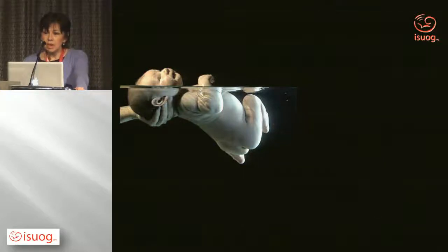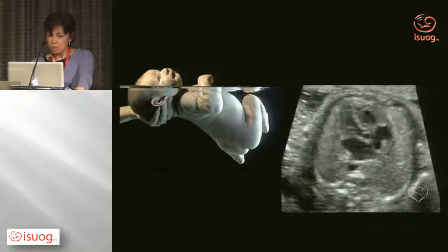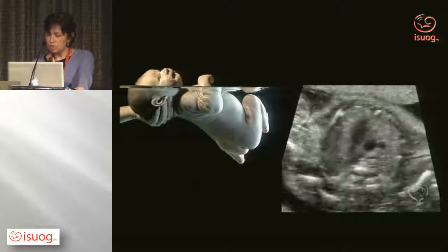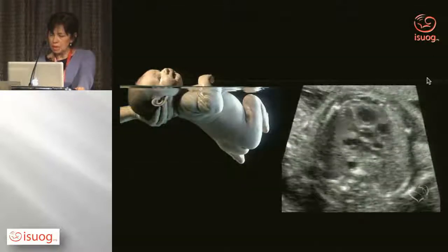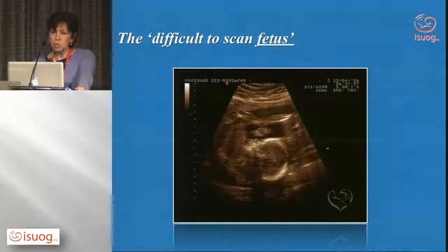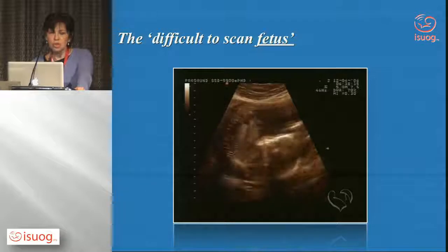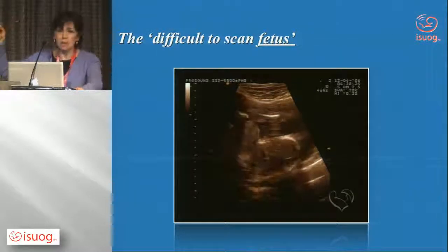So would we need guidelines if we had all our patients with lots of amniotic fluid, all nice and happy in a good position, and within 2 seconds we would have a transverse sweep from the abdomen to the three-vessel trachea view, and it would be very easy? But we do need some kind of structure to see the heart. I'm not sure how the clips are projecting with the lights. Can you see them?